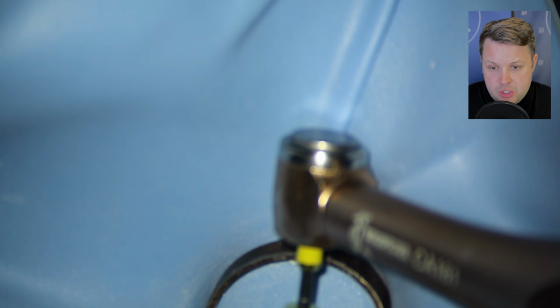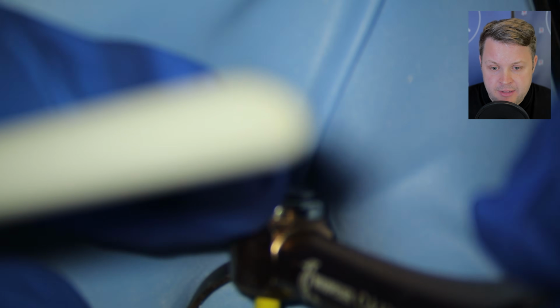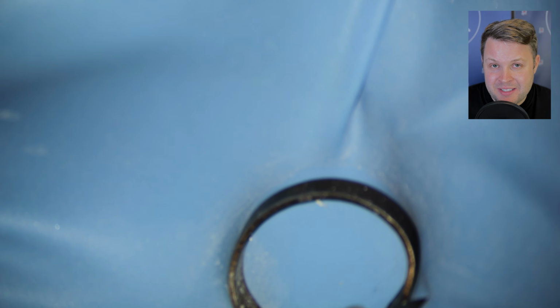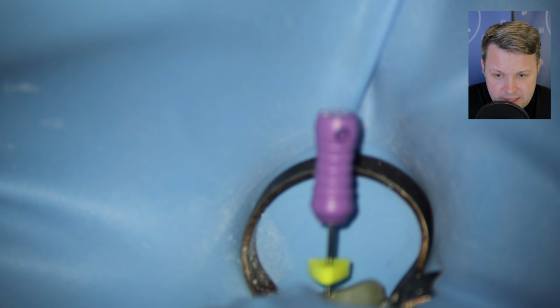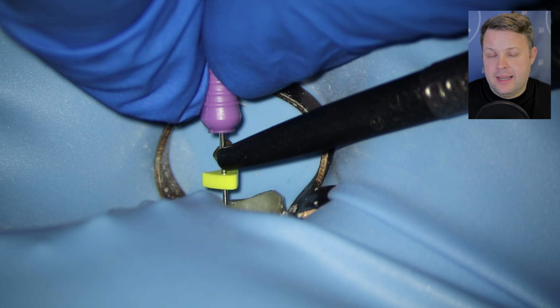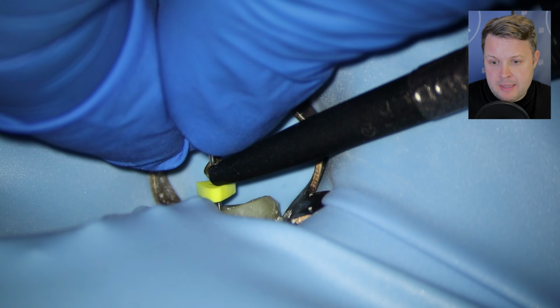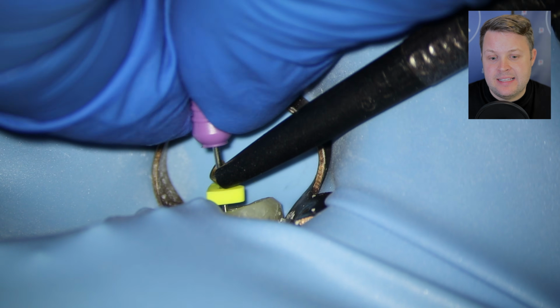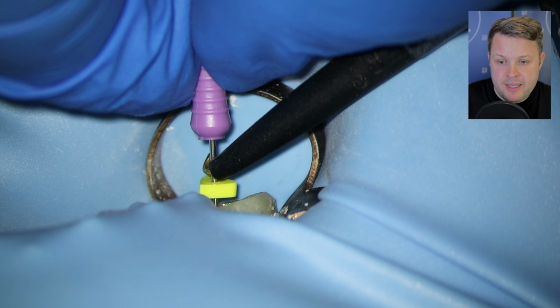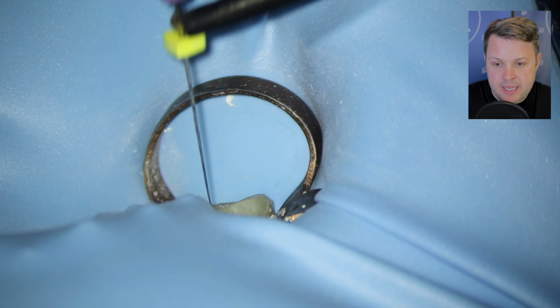So I'm going to do some further shaping with a size 20 Hedstrom. Be careful with this file; I've fractured this file a few times doing this. Then I'm going to use a D-finder to try and get to the working length. I haven't got a picture of the apex locator here because I just cannot get to the 0 reading. So I'm winding this D-finder, and it's getting stuck at the end.